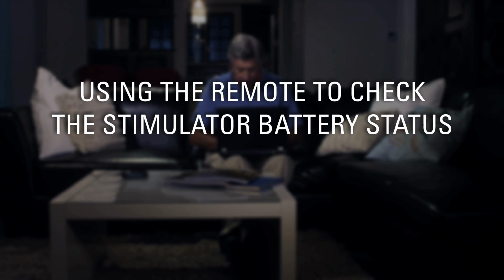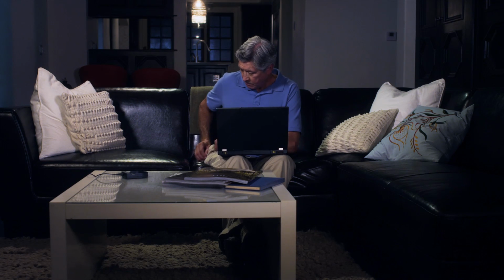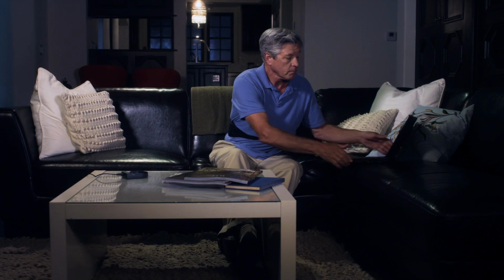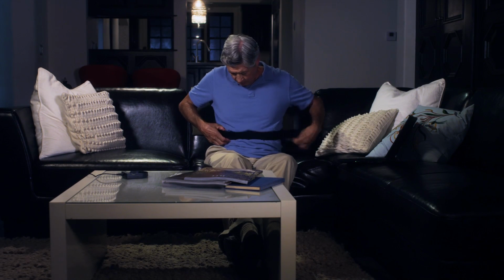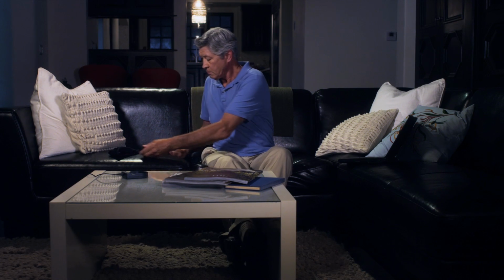Using the remote to check the stimulator battery status. Your remote control displays the stimulator battery status when communicating with your stimulator, but the remote control will not be able to communicate with the stimulator when charging. To check the battery status on your remote control while you're charging, first turn the charger off. Then check the battery status indicator on the remote control.